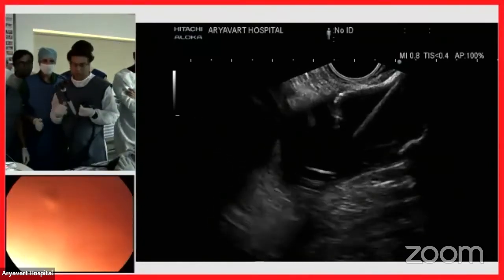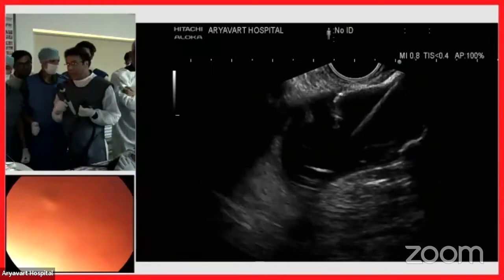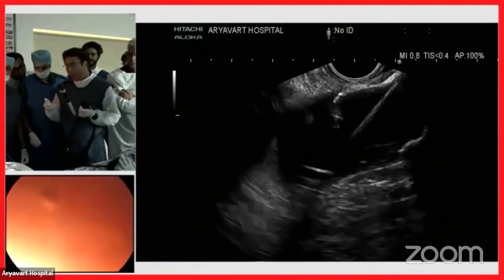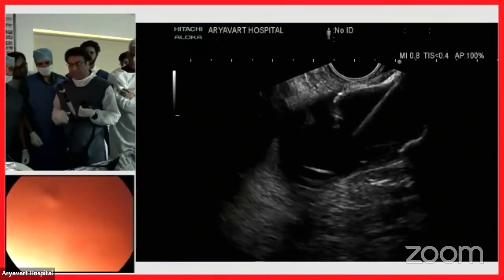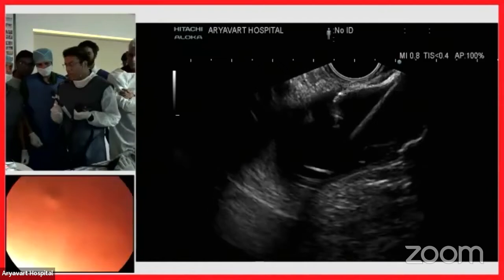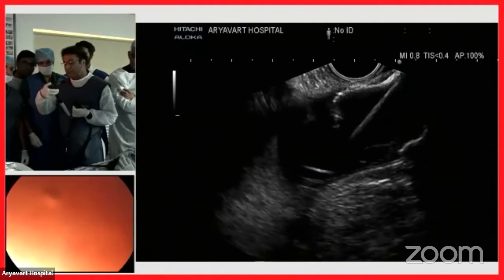comes the fourth part, which is the proximal deployment, or the opening up of the proximal flange. Now this we are doing in the scope channel itself. I'm not going into the endoscopic vision. I pull this, and I think this position is fit enough so that the other part is in the stomach and not somewhere between the stomach and the small bowel. So the last part, we will deploy the proximal flange.